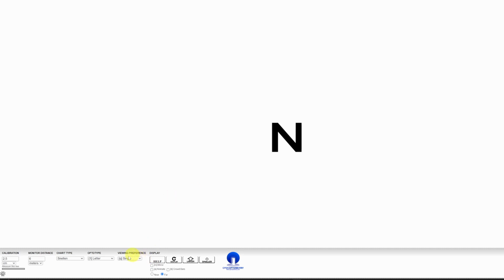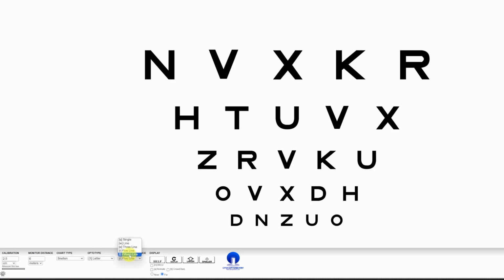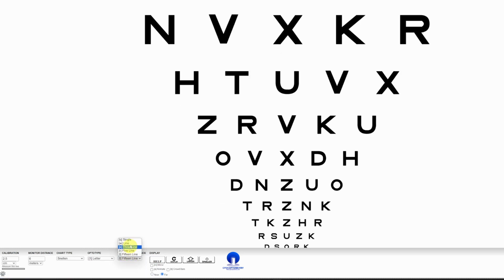So you'll see that, for example, on Snellen Vision Acuity here, there's different options. The numbers on your keyboard or on the remote will change it from a letter to pictures, to C's to E's, but I've added shortcuts for those. But you can see if you use your keyboard, the numbers 1 to 7, change that. So if I go back to letters, and then the letters Q, W, E, R, T on your keyboard will change it from a line to 5 lines to 15 lines, depending on what you want.